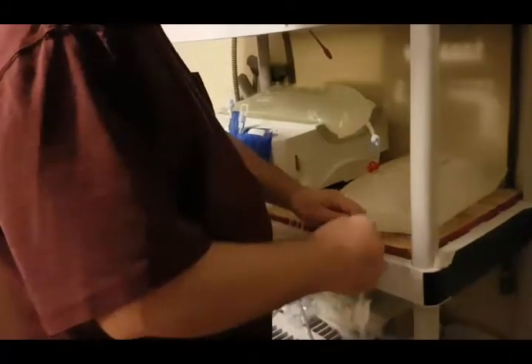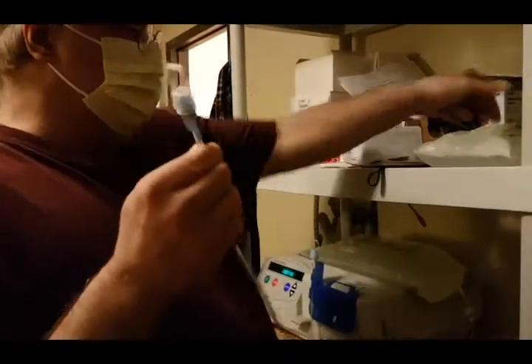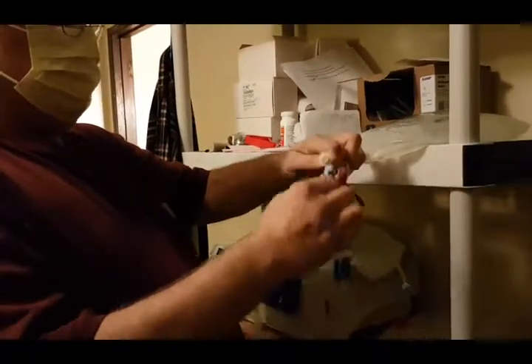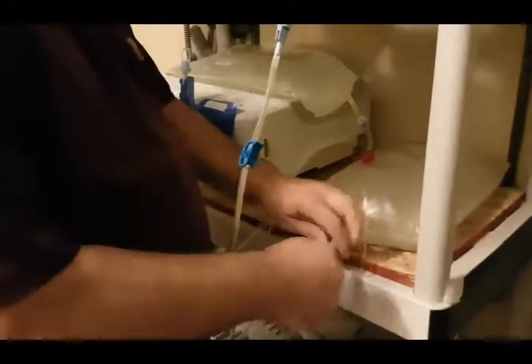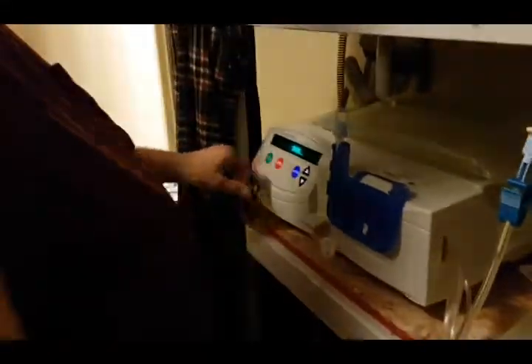So I'm holding the stem here, and no chance of getting it dirty or contaminating it. Again, I loosened it, but I didn't remove it. Well, okay, there we go. Pull, pull, connect. The next thing to do is open the clamp on the patient line, break the frangibles, open clamp, break frangibles, open clamp, break frangibles. Hit go.